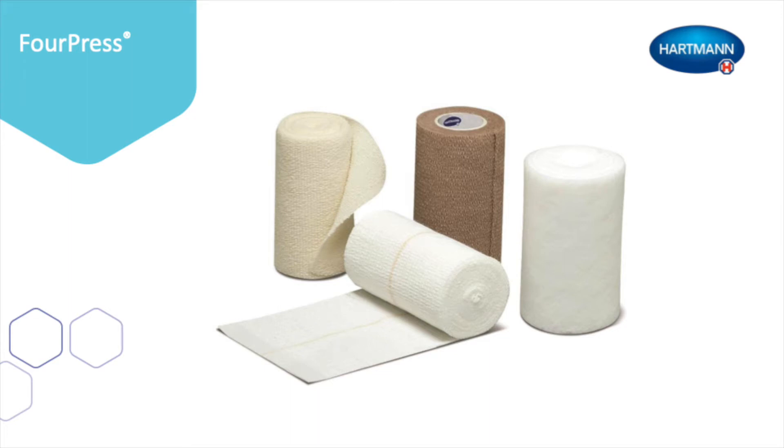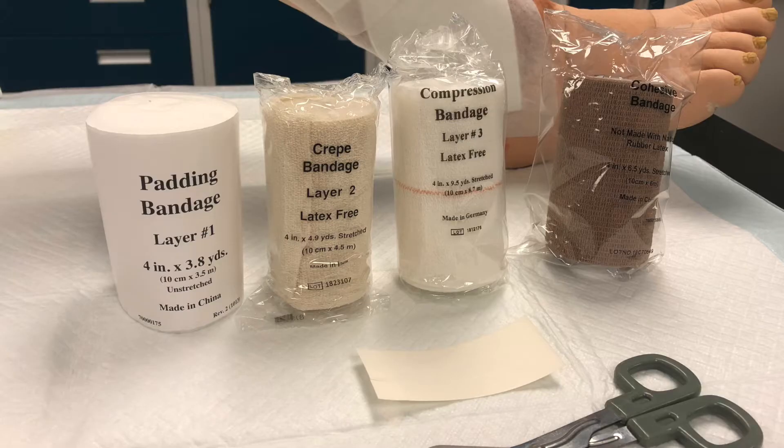ForePress is a four-component compression system consisting of a padding, a crepe, a compression, and a cohesive bandage layer. The four layers work together in the management of venous leg ulcers by providing sustained compression between 30 and 40 millimeters of mercury, for use for up to seven days.